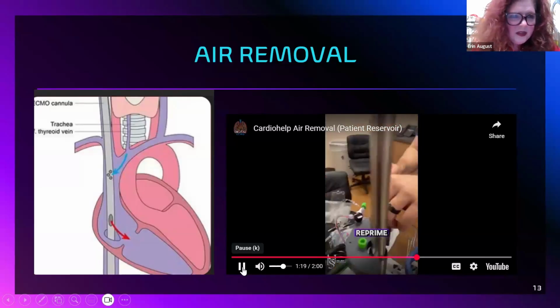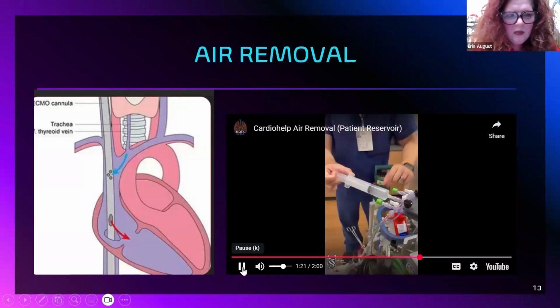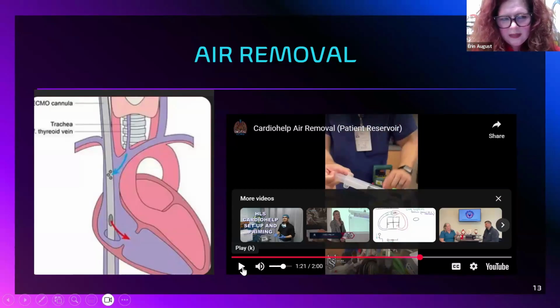And you see, again, I added this with the manifold just because that way we're addressing both adult and pediatrics. Most places do not use the manifold for adults. Some do though. But in the peds world, manifolds are used almost always.